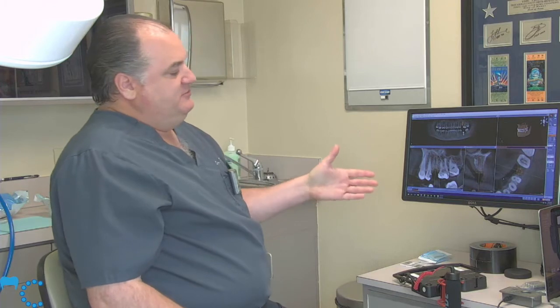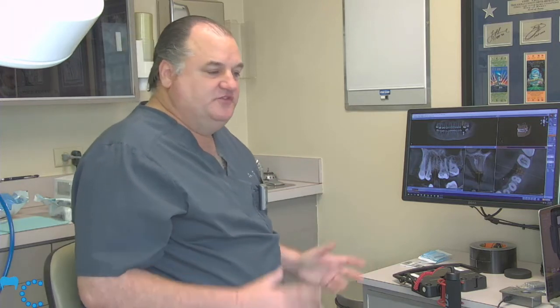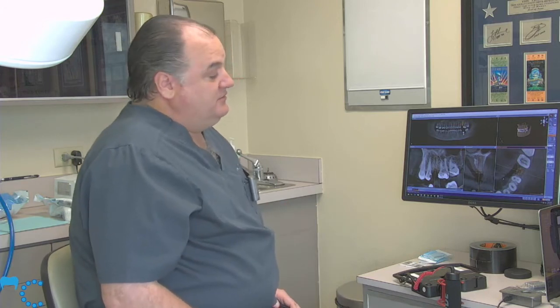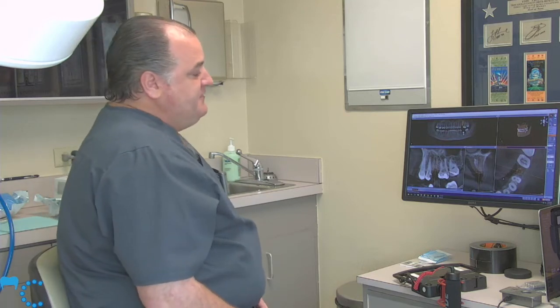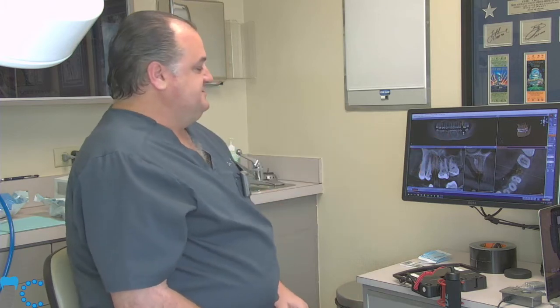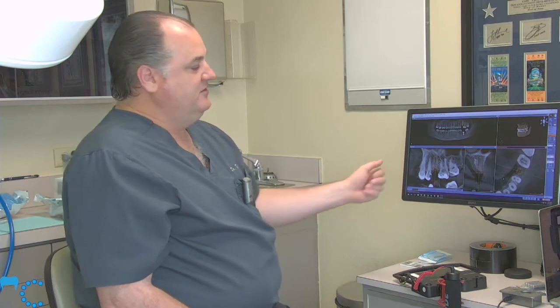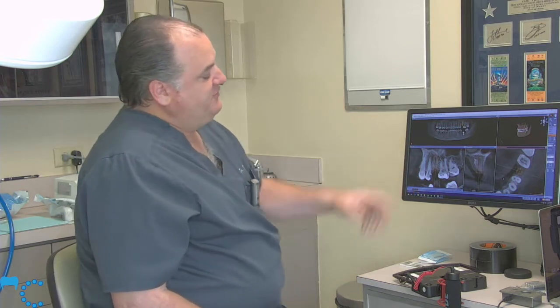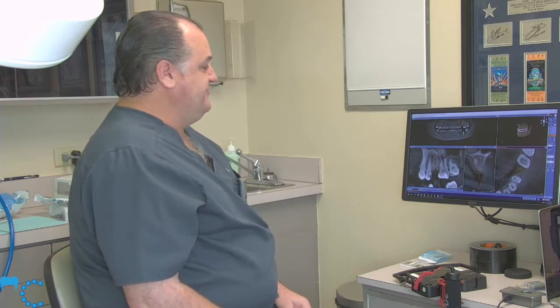And with the titanium implant system, what we usually see as a pre-failure event is we see the screw loosened, and then we have a loose crown abutment complex or a loose screw-retained crown, or worse things happen. We get deformation of the implant or the abutment. So again, we're trying to compressively load our implant with the ideal restoration, in this case a single tooth premolar crown that's going to be cement retained by a cemented abutment into our ceramic implant. So positioning of our implant is important to satisfy this.